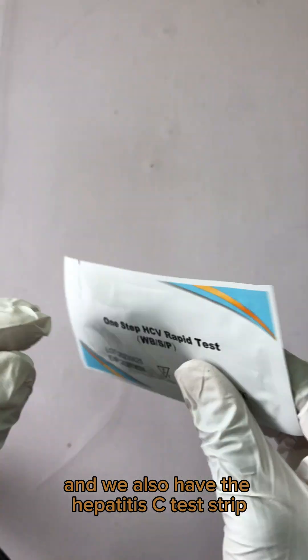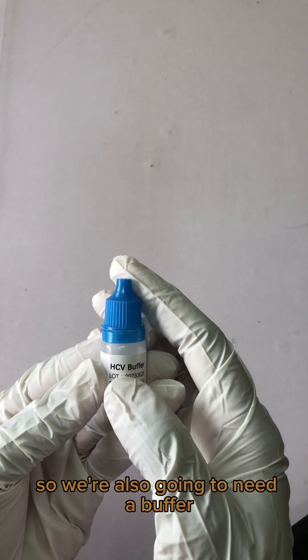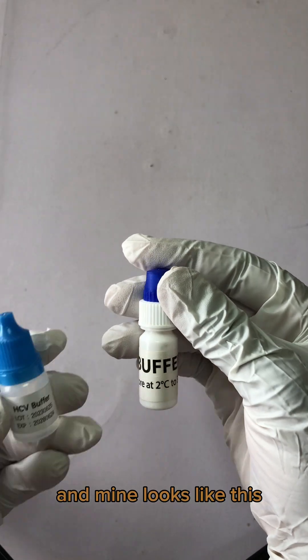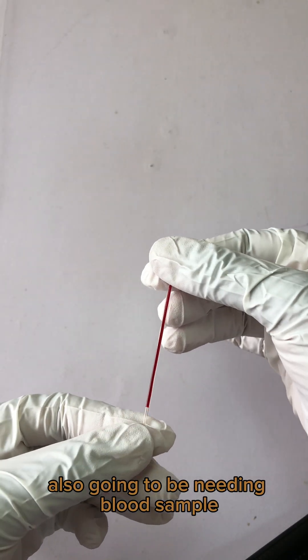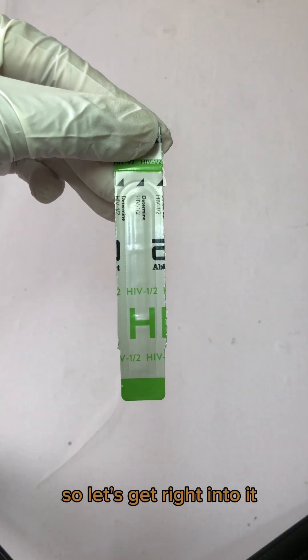And we also have the Hepatitis C test strip. We're also going to need a buffer, and mine looks like this. We're going to be needing a blood sample which I've already collected in this capillary tube. So let's get right into it.